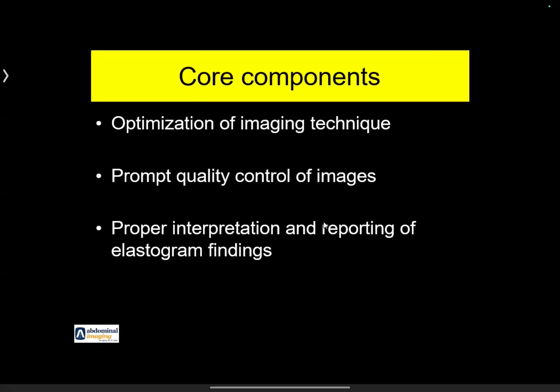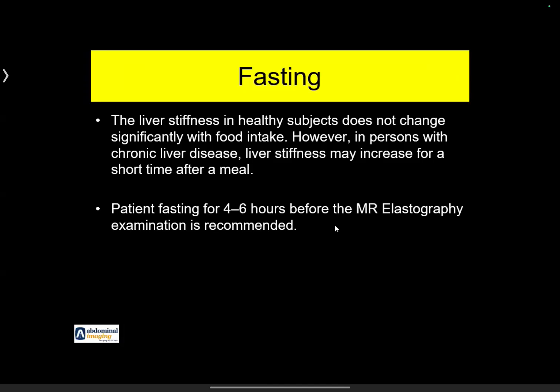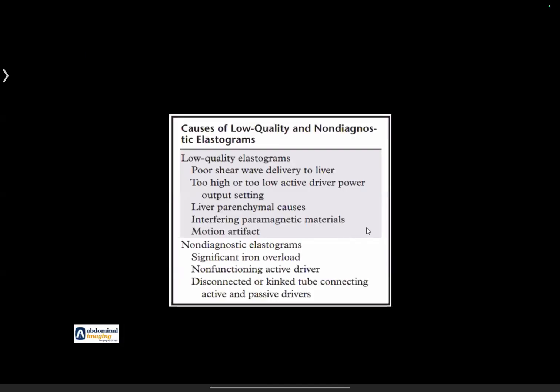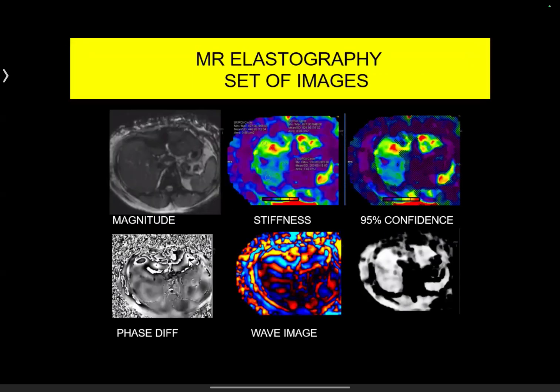The core components of MR elastography are optimization of the technique, maintaining the quality, and appropriate interpretation. We'll go to cases. Actually, it's a long talk; I want to show cases rather.